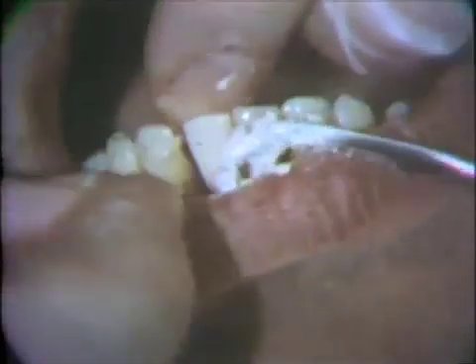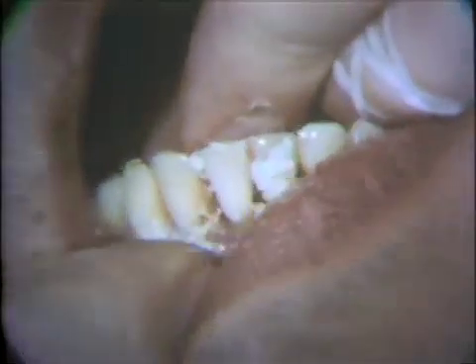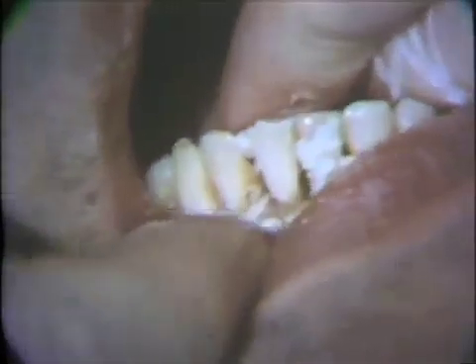The most common method for interproximal polishing is the use of dental tape and polishing paste, as shown here in the mandibular incisor region. This is somewhat time-consuming but is effective in polishing the interproximal surfaces of teeth.